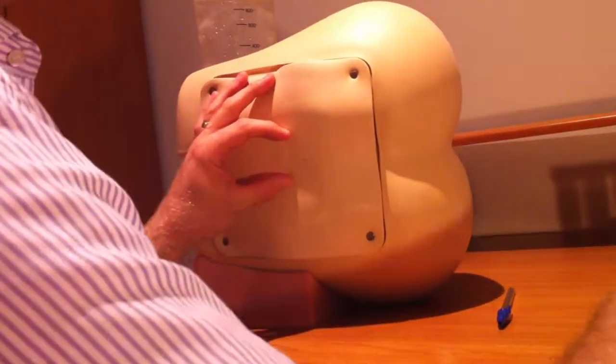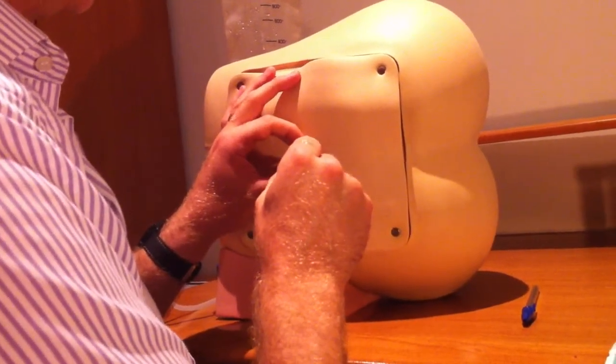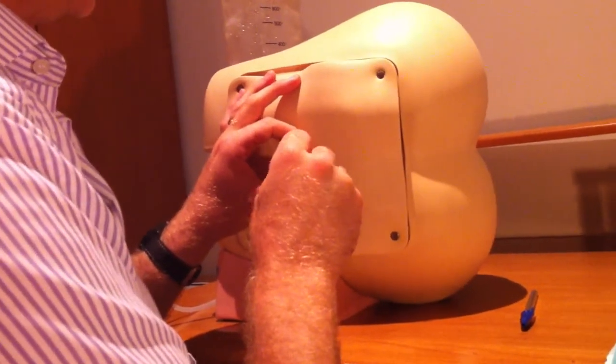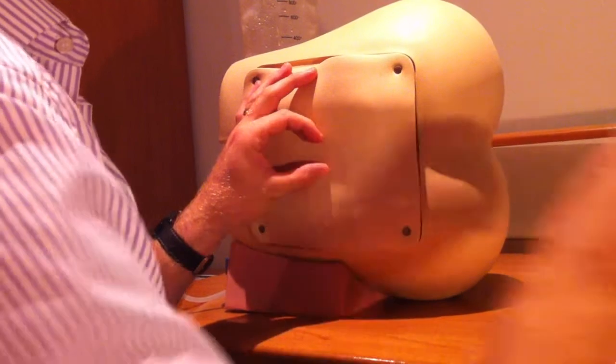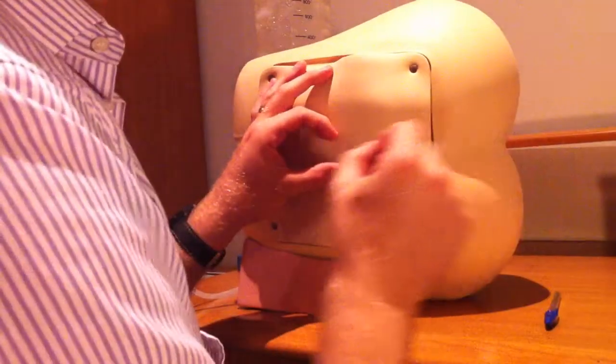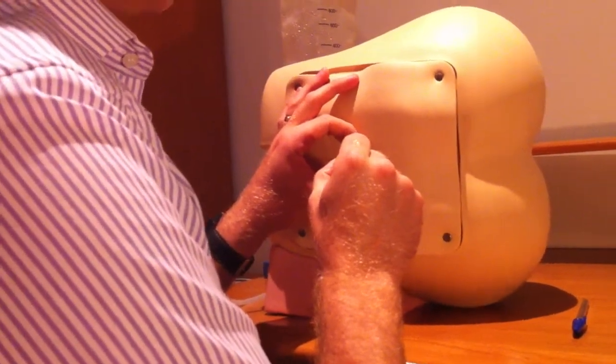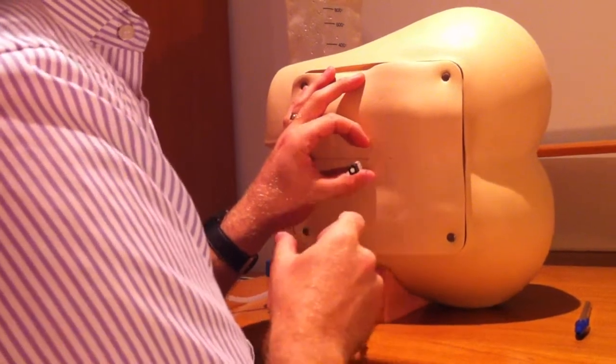My own practice really is to favour just using the local anaesthetic. Rotating it slightly to make sure I've made a small entry point in the skin and then inserting the atraumatic needle through that small hole.